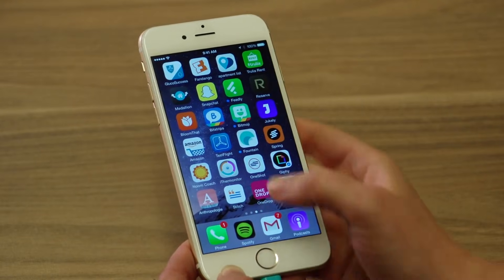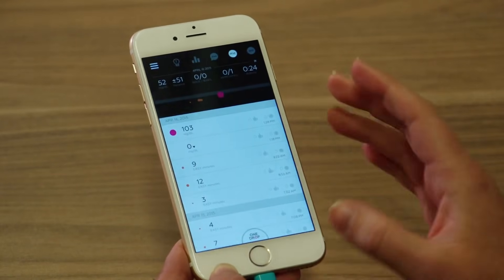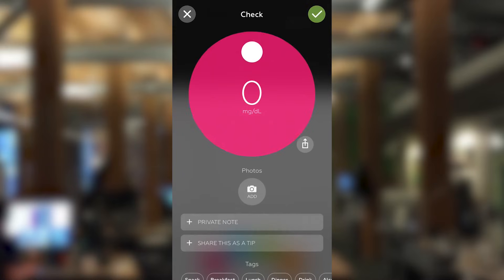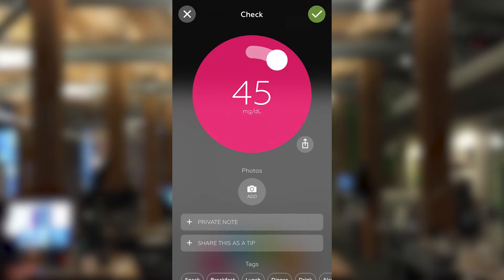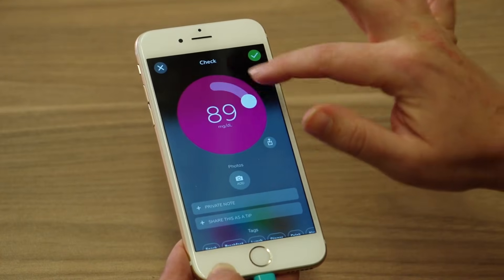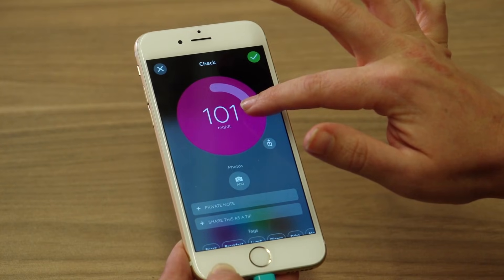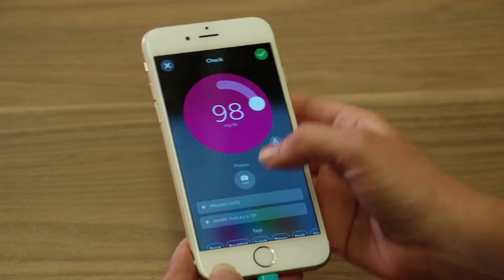Today I'm going to show you a diabetes tracking app called One Drop. It was created by the co-founder of Razorfish, Jeff Dachas. Let's get right into it — let's start by opening the app. The first thing we're going to do is check our vitals. This would normally be done with a glucose reading meter. A normal person will have somewhere between 70 to 110. We've got 98.